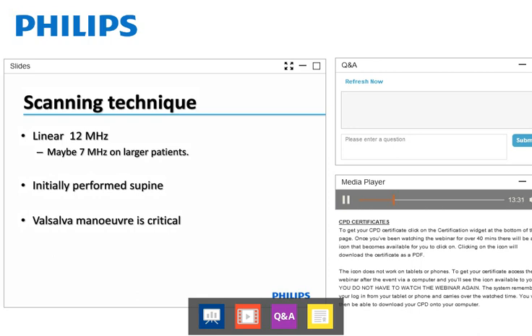I don't get the patient to cough. Unlike a GP or a doctor, when they're clinically examining the patient, will often get the patient to cough. When a patient coughs, things move too violently and too quickly, and you tend to lose your landmarks.